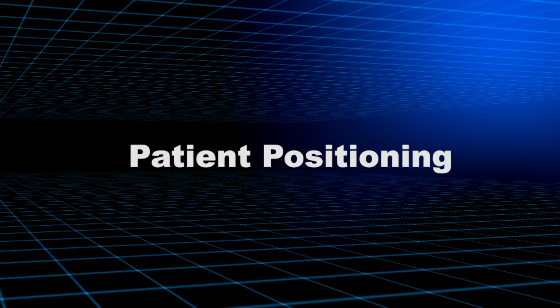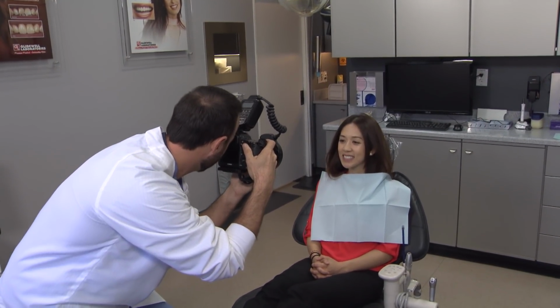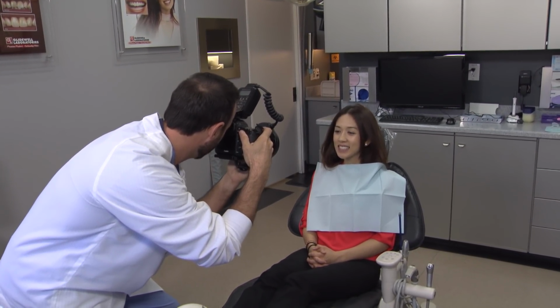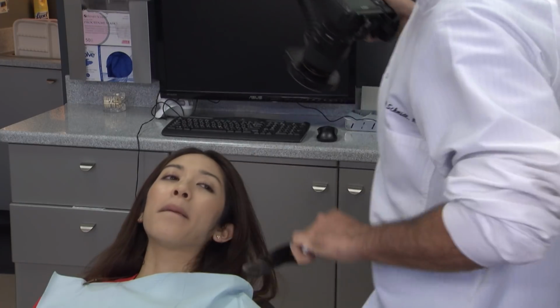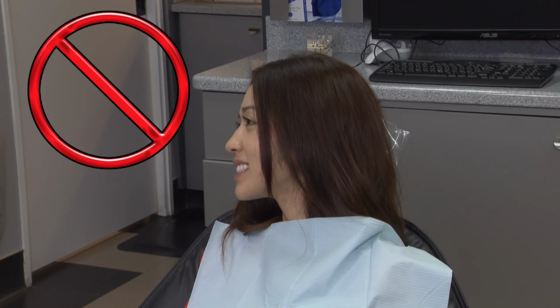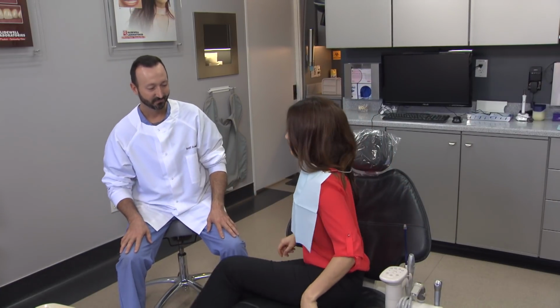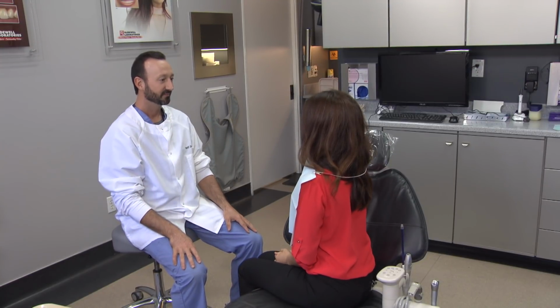Before even picking up the camera and starting to shoot photos, it is important to first position your patient in a manner that will assist everyone involved in acquiring the correct angulation and the proper photo. Not only does this set us up for success, but it allows the patient to prepare for the session and to become involved. Instead of asking your patient to turn their head towards you, position the patient to take an image straight on with their body position in alignment with their head, preventing unnatural stretching or angling to compensate.